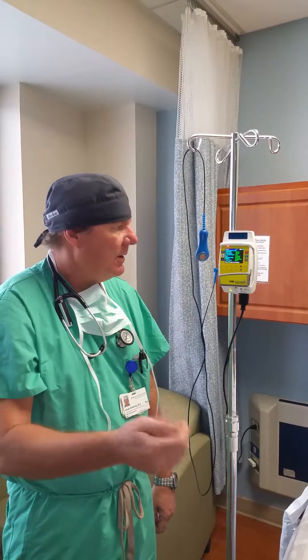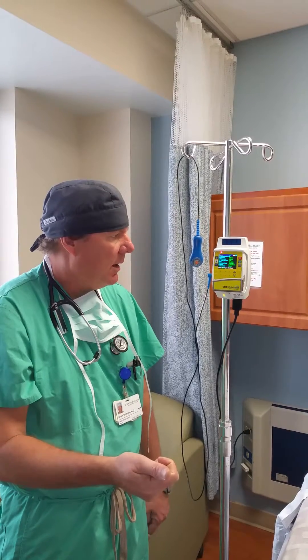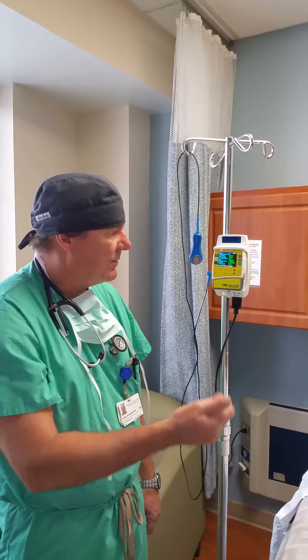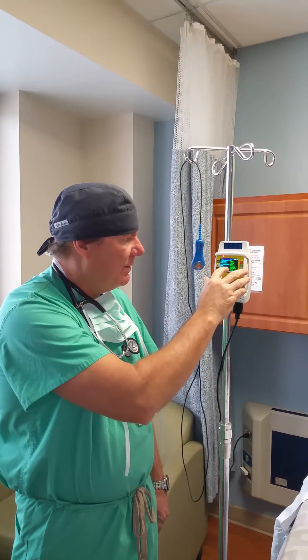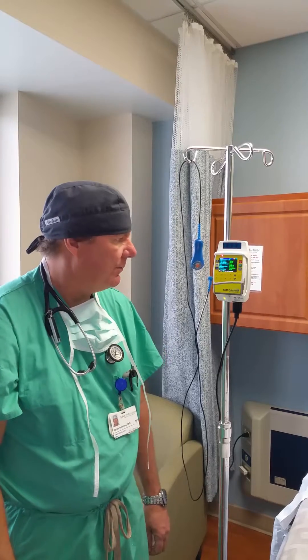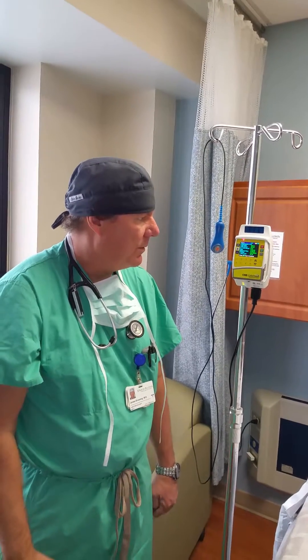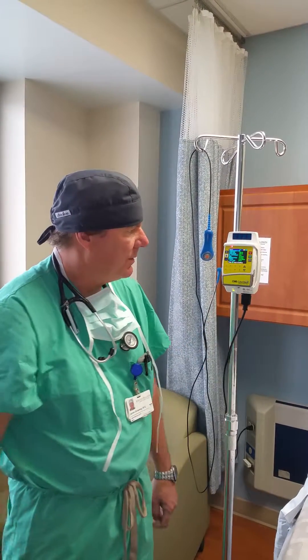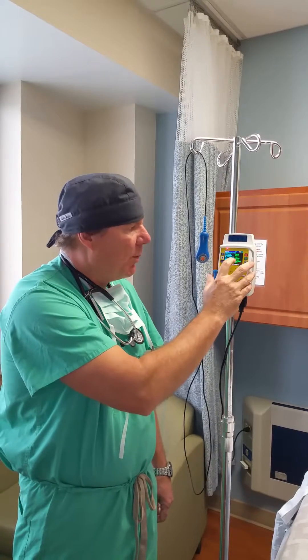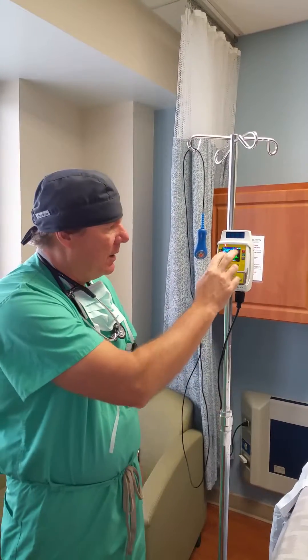They'll feel the bolus before they can give themselves another one. After each 30 minutes, if they want another bolus, there's an absolute lockout of 15 milliliters an hour. The maximum rate is 15 per hour — you start at 10 and can go up to 15 milliliters an hour.